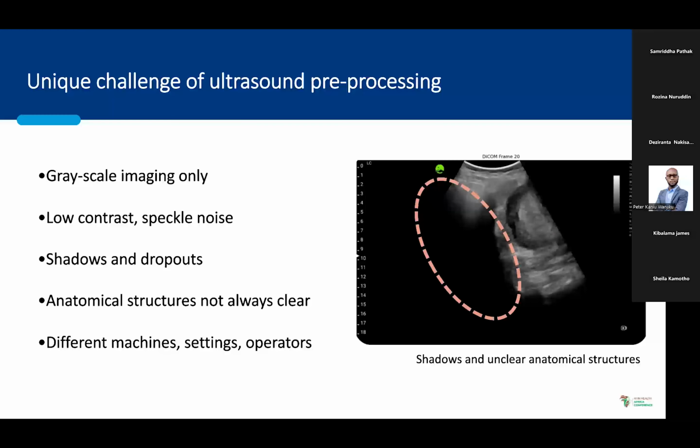There are also some unique challenges particularly associated with ultrasound. The B-mode ultrasound images are mostly grayscale, and depending on the devices, they may have low contrast.